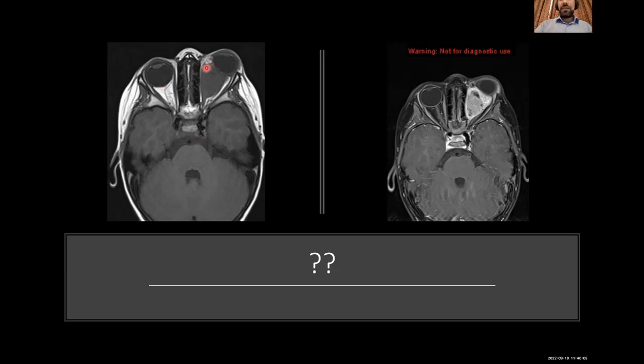The muscle is indistinct, so tell the examiner that the intraconal muscle is indistinct, I have to rule out rhabdomyosarcoma. So I wanted to review the patient history, because hemangioma at that age should regress. Hemangioma is not flaring, it regresses.